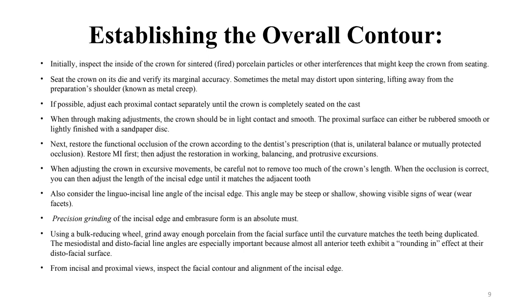And again, with the embrasure, especially for the anterior teeth, why is the gingival embrasure important? Aesthetics. There is the golden rule. I don't know if you heard about the golden rule, okay? The golden rule says that everything has to be in proportion. So if I take my finger and make a ratio between my finger and my palm, it should be 1.6 of my finger, right?